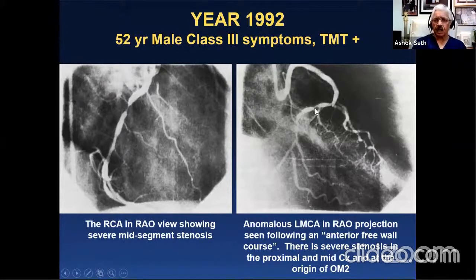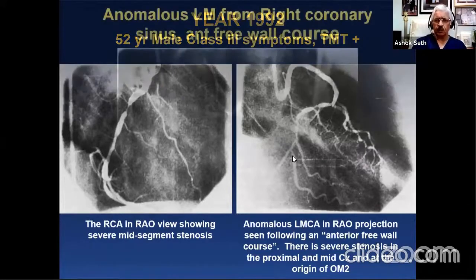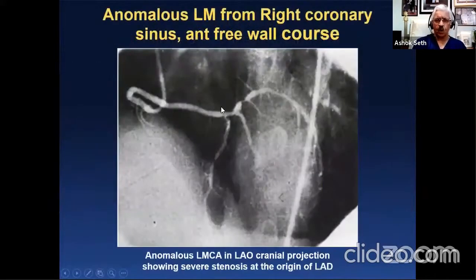It actually has a high-grade stenosis in the circumflex, and then, of course, a long stenosis further down going into the OM2. This patient also has a severe ostial LAD stenosis. Admittedly, the LAD is not the largest of the vessels, because the RCA was dominant, as well as the circumflex. Well, this guy refused surgery and therefore became a candidate for balloon angioplasty in those days.